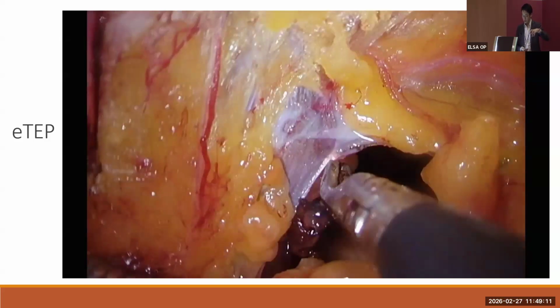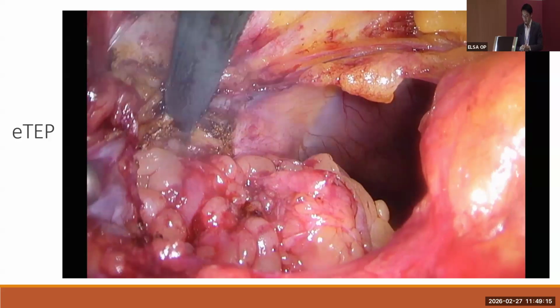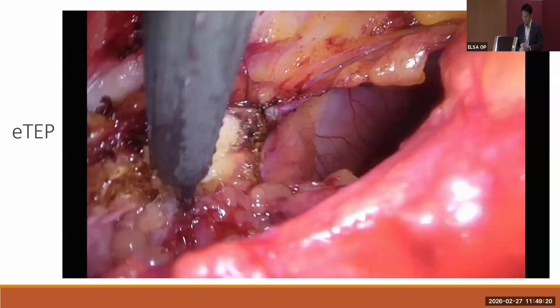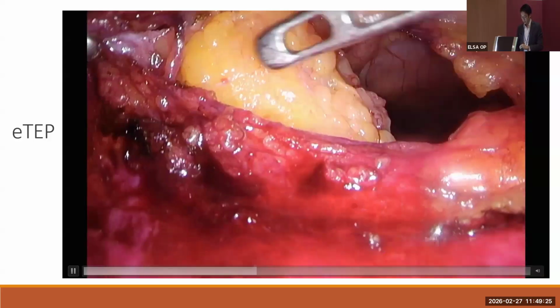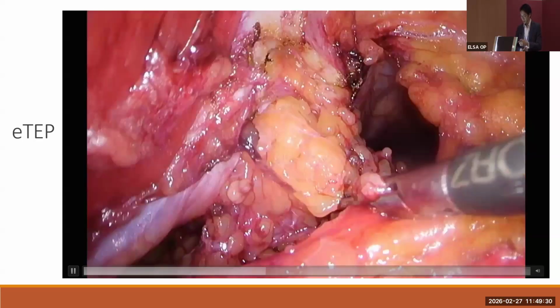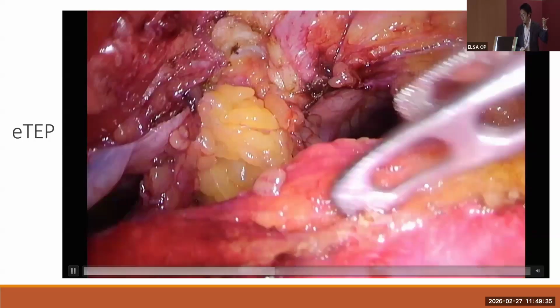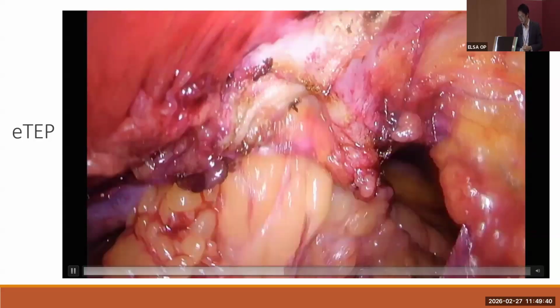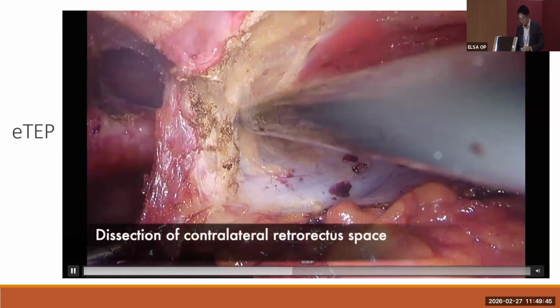In this case, the umbilical hernia was still quite badly incarcerated with fat, so we decided to open a hole in the posterior sheath and the peritoneum so that we can do reduction of the omentum. So there was quite a bit of omentum that we had to reduce. And I always tell the juniors, the MOs, and the registrars who scrub with me, this is probably the most satisfying moment of a hernia surgery, where you keep on reducing omentum, right? Quite fun, to get all this stuff out of the hole. Okay, the little joys that we hernia surgeons get.